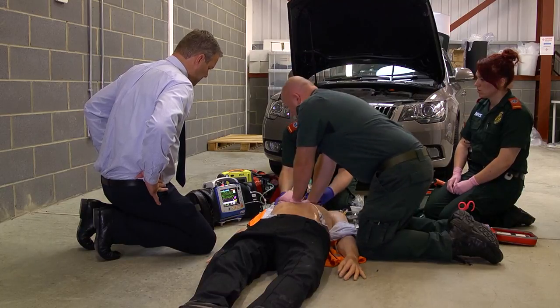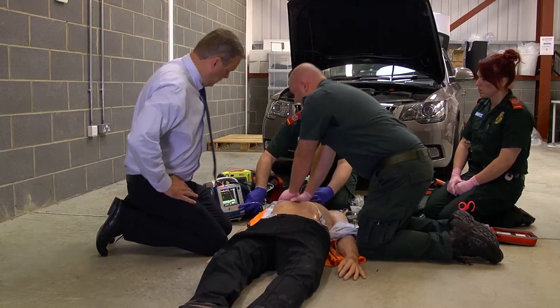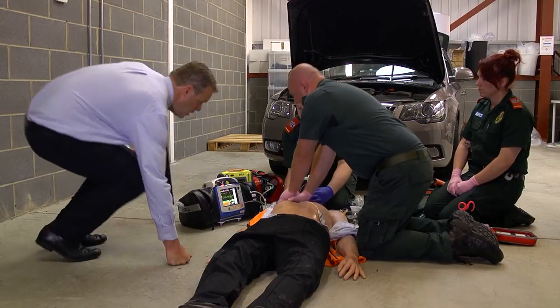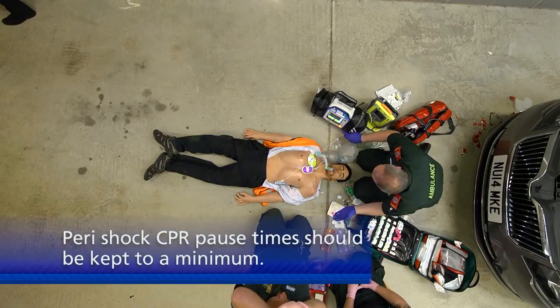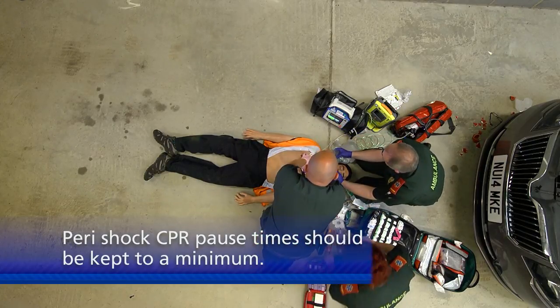Okay. Happy to charge because that still looks like VF on the see-through. No, I'm absolutely fine at the moment, yeah. Okay. We are charging. Yeah, that's fine. Just give me a shout when we're at time and we'll have the charge. Five, four, three, two, one, I'm clear. Clear, still in VF, everybody clear. Shocking, shock delivered. Was that shock five?